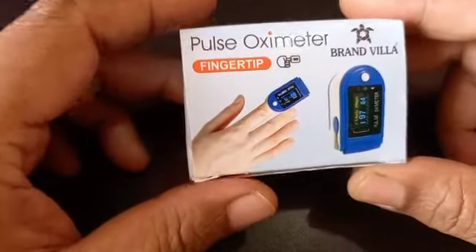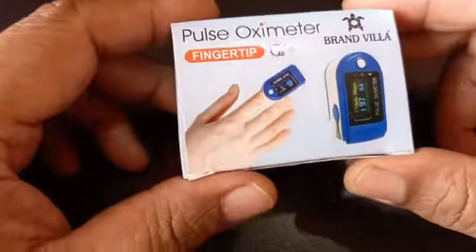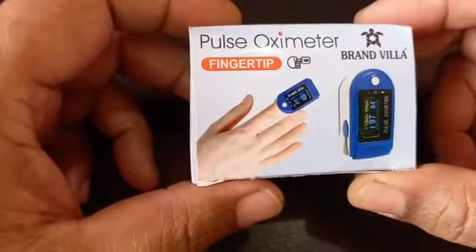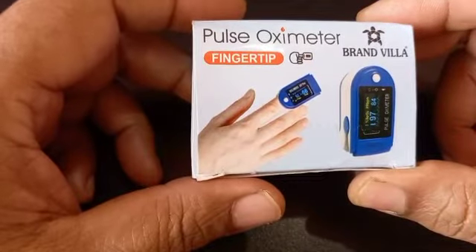This Pulse Oximeter I purchased a few days back from Amazon. The cost of this Pulse Oximeter was ₹1100, whereas the MRP of the equipment is ₹2999.